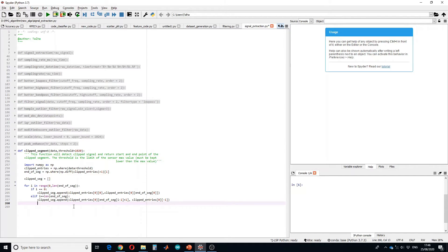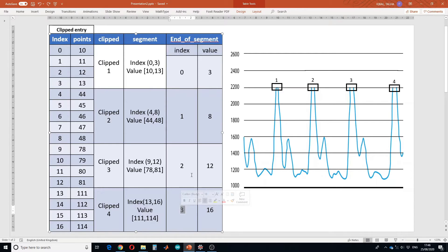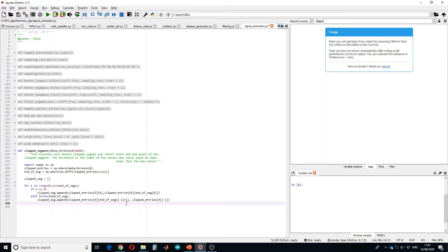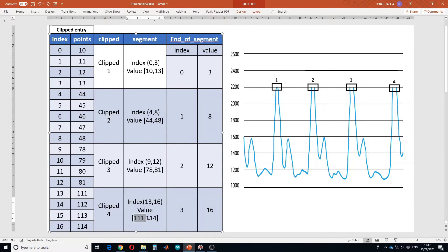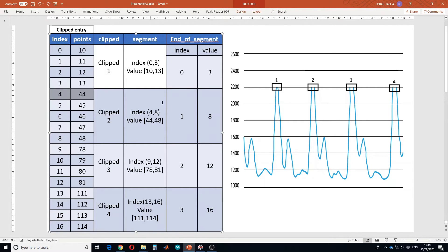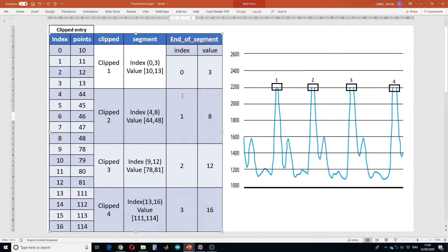For the last segment, the input is picked from clipped entry first column at i-minus-one plus one — the one previous to the i-th end-of-segment value is 12, and plus one gives 13. For the last entry we pick the first column and the last entry, which is 114. For the in-between segments, i will be 1 and 2. Considering i equals one, the second segment values are 44 and 48. The value 44 is at clipped entry first column fifth row.